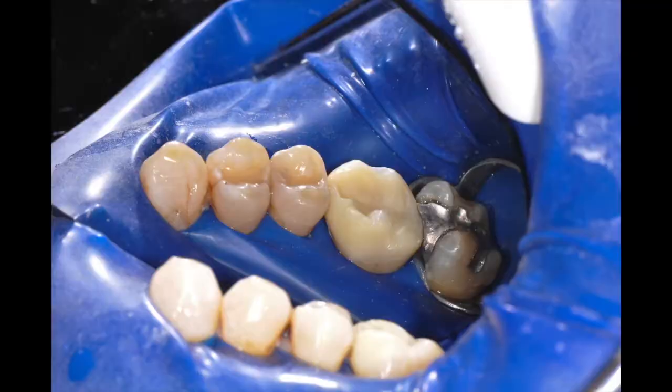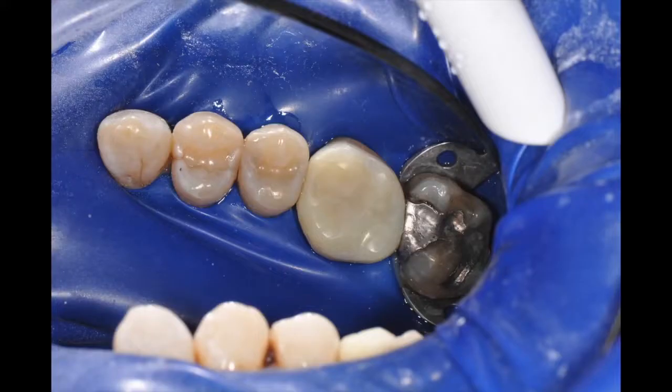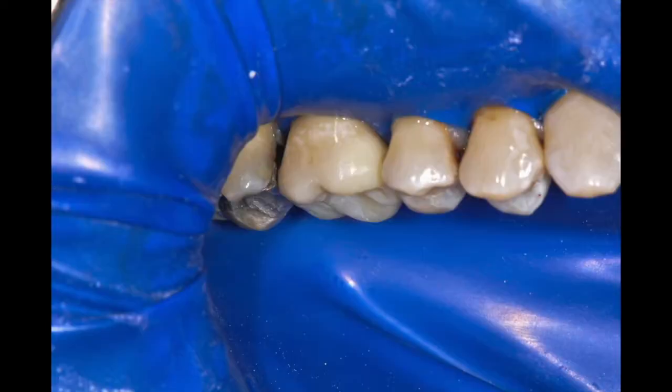Now that the onlay is heat processed and ready to cement, the rubber dam is placed and the onlay tried in. Contacts are usually perfect and the margins should be nearly closed. The preparation is refreshed with 27 micron air abrasion and thoroughly rinsed. Teflon tape is used to protect the adjacent teeth. The tooth is primed and bonded.